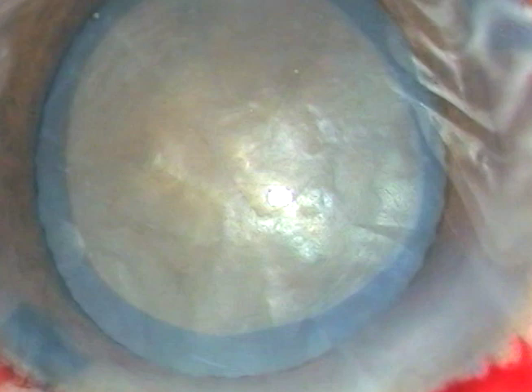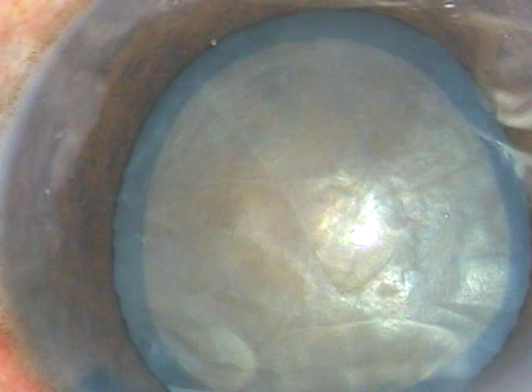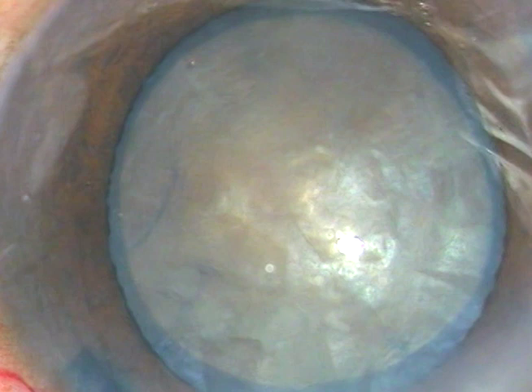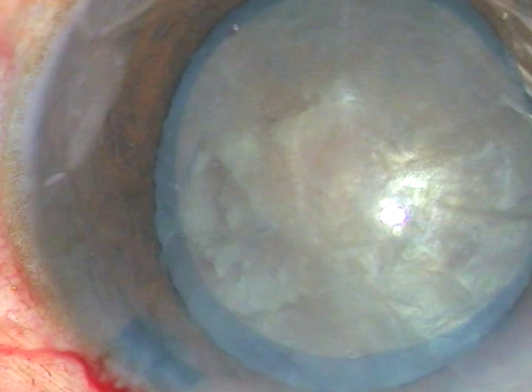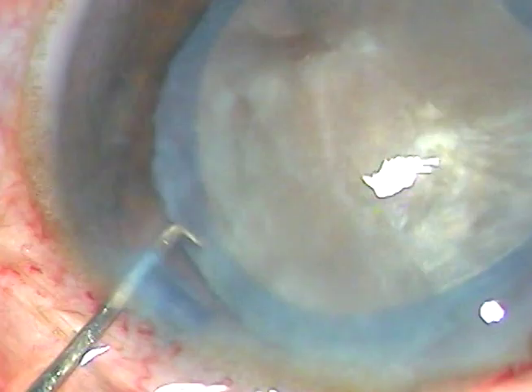Now hydrodissection. We cannot see the fluid wave going to the other side clearly, but we can observe that the nucleus gets lifted up a bit. I go to the other side, tap the nucleus twice, and do a little hydro on the other side as well. Hydro is done at multiple points with small aliquots of fluid. The nucleus is then rotated, visco is again injected, and now it is time to go in.